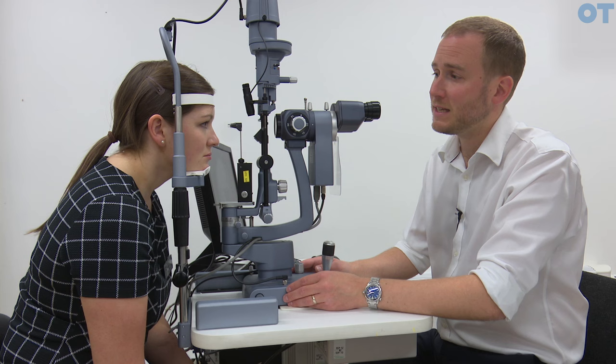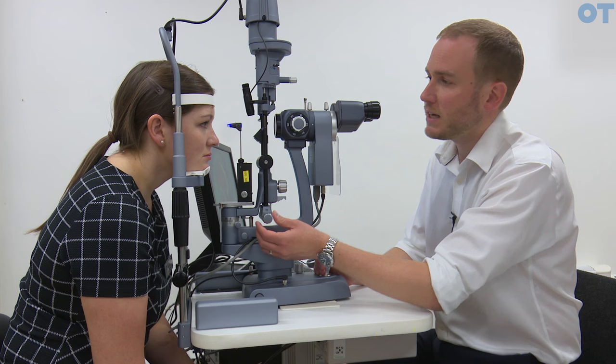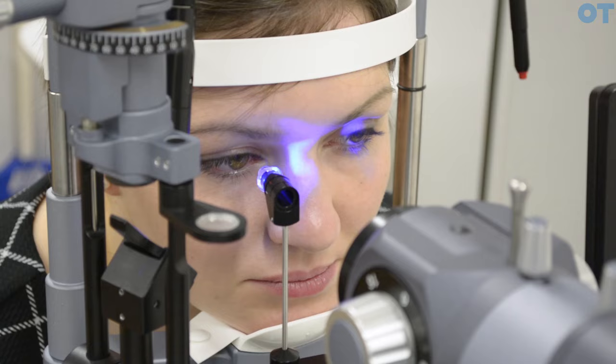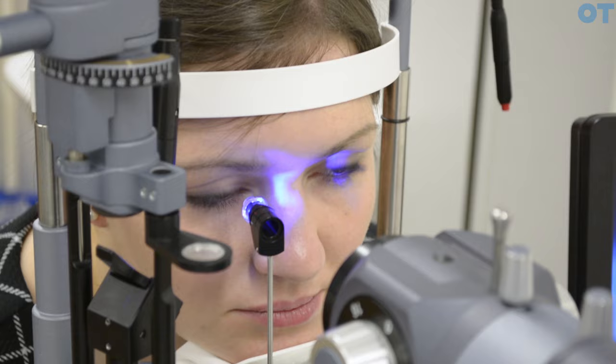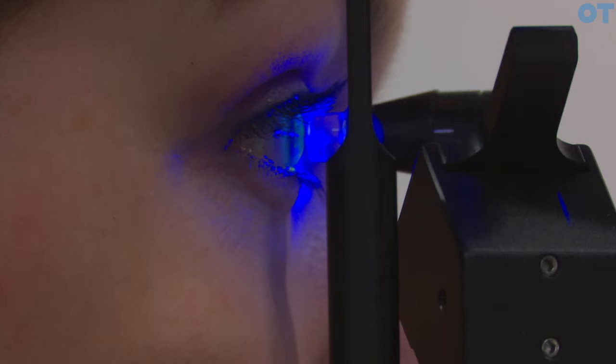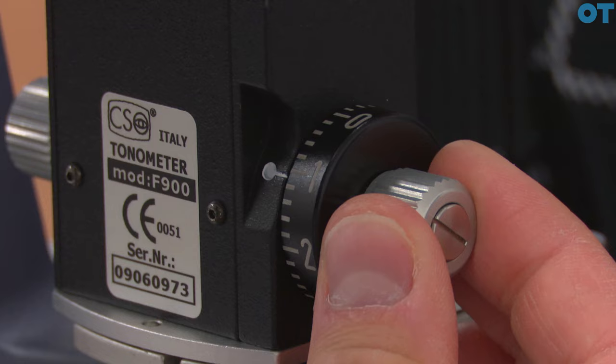We're going to applinate the right eye. We've instilled Proximetacaine as the topical anaesthetic and also some fluorescein so that we can see the mires and the associated endpoint. We align the instrument with the patient's right eye with the light source on, bring the light source to the patient's temporal side, and then bring the probe close to the patient — giving the patient a target to look at, advising them to look towards the side of the slit lamp. We have the probe on 15, then bring the probe close to the eye until we applinate the eye.